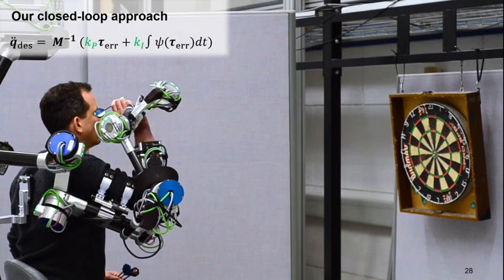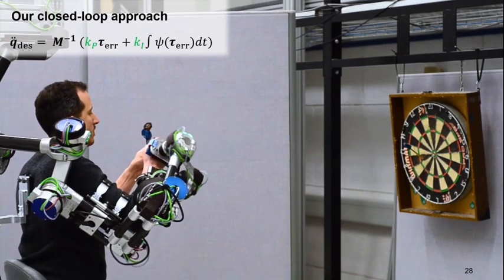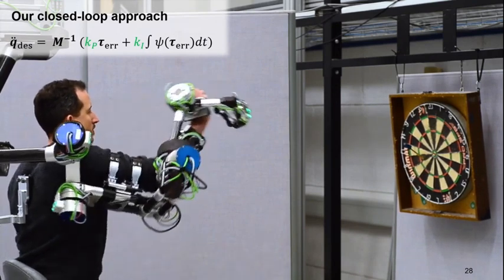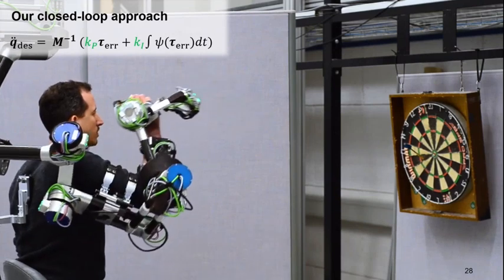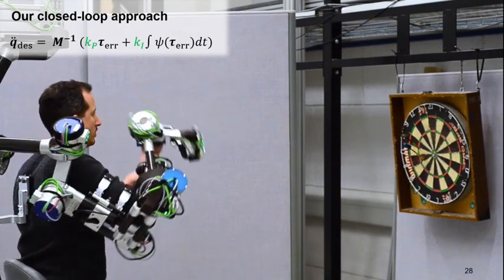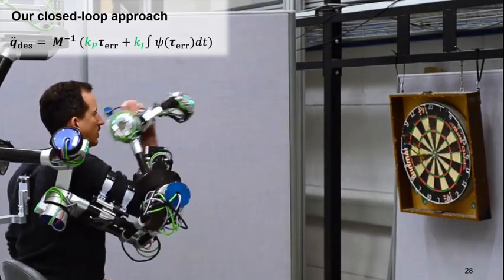Thereby we could achieve highly transparent behavior even in the presence of dynamic movements of the human. Here we demonstrate it by throwing darts. By the way, without the robot I'm not really much better at this.